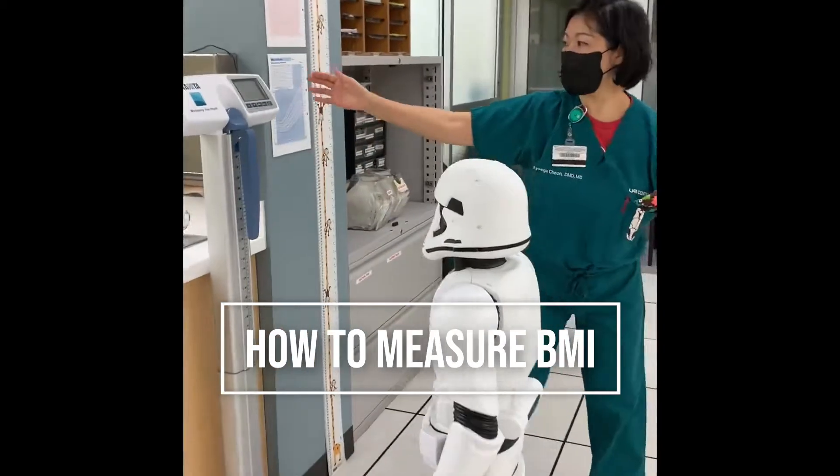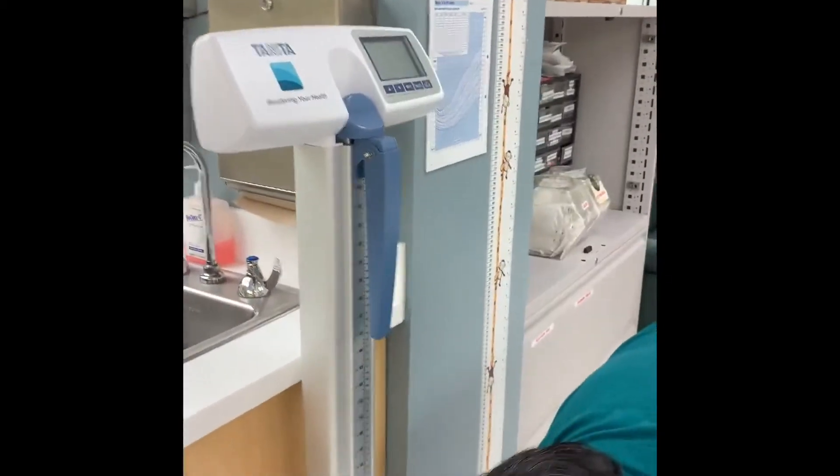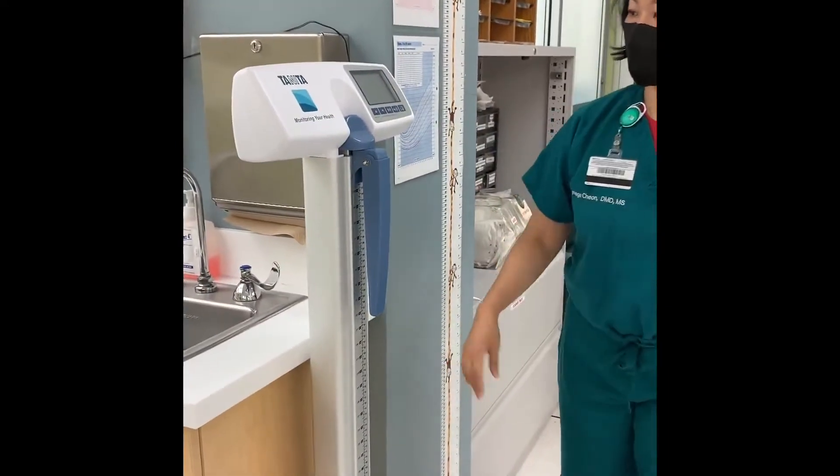This is our BMI checker. I want you guys to utilize this one.